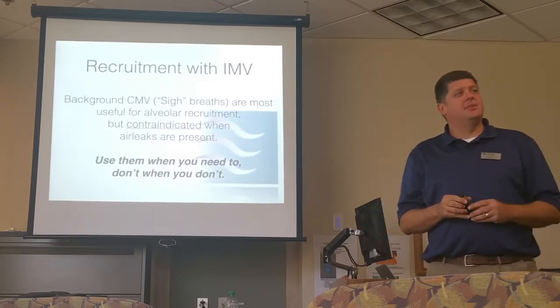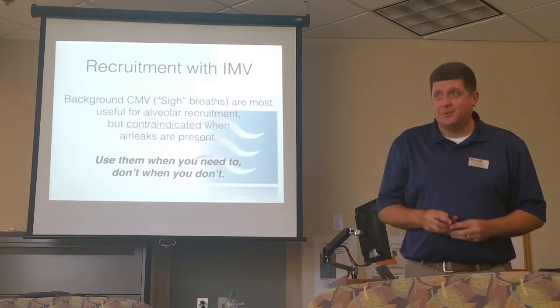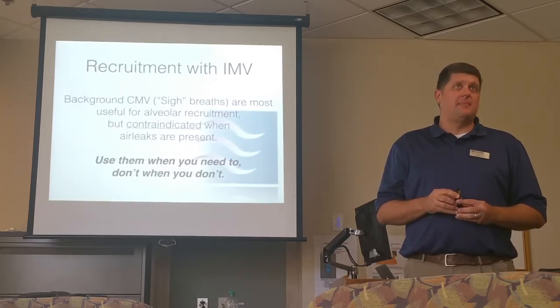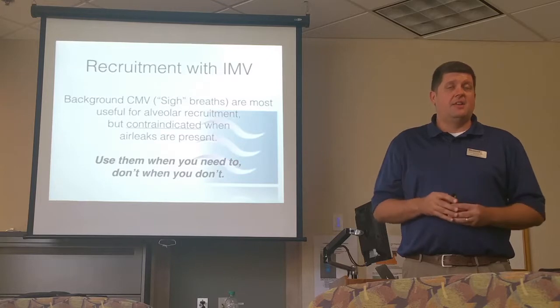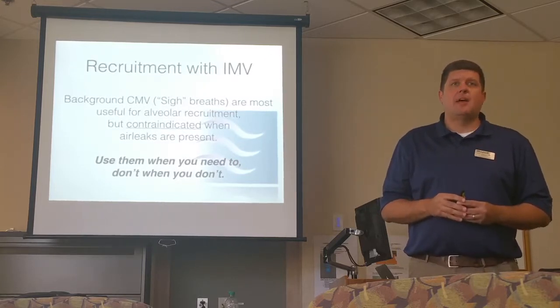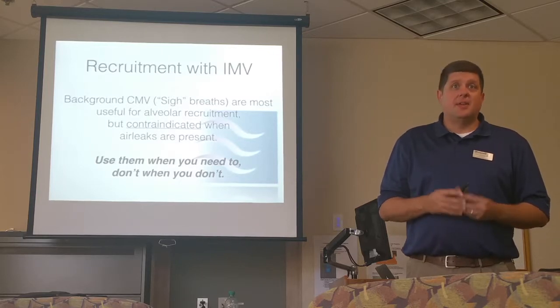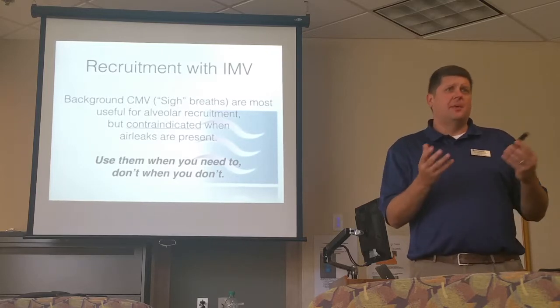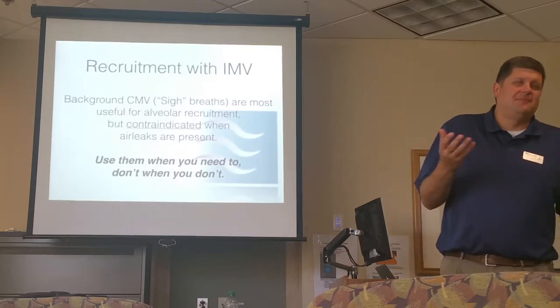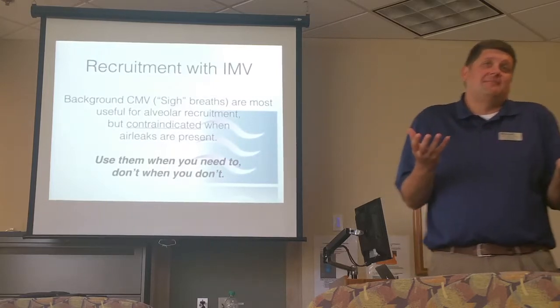But what you can do is dial down the pressure control, right? Your PC above PEEP. So if normally your PC above PEEP is 10, for a total PIP of 18, let's just say, bring the PC above PEEP down to where it's only 5. So then, even when that rate of 3 comes on, your total PIP is only 15 or whatever, and it's not a lot.